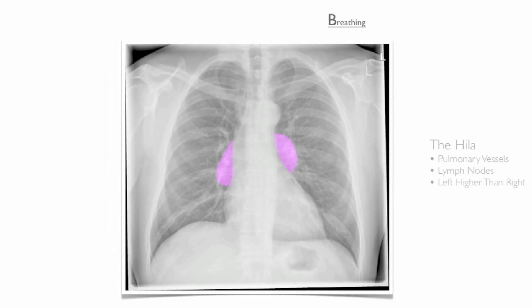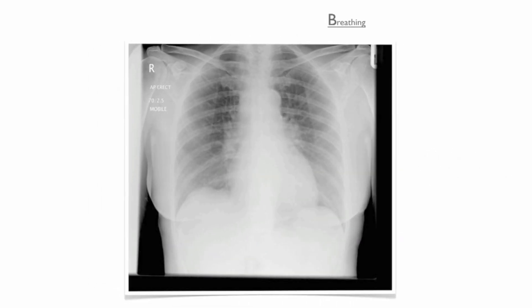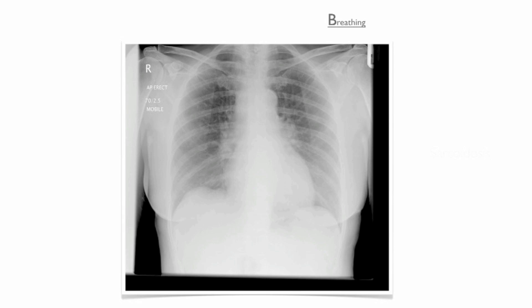After reviewing the lung zones, look at the hyla. Hyla contain the pulmonary vessels and lymph nodes, and may become more prominent in some diseases. Bilateral hyla lymphadenopathy is a frequent presentation seen in exams. Whenever you see this presentation, your differentials should include sarcoidosis, tuberculosis and lymphoma.